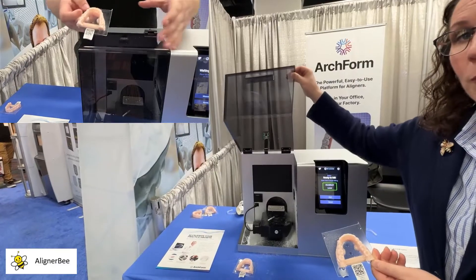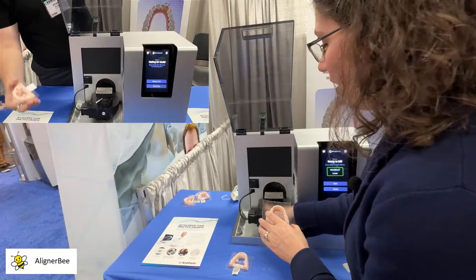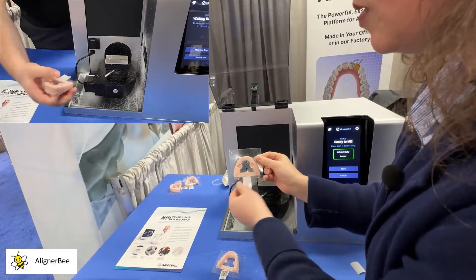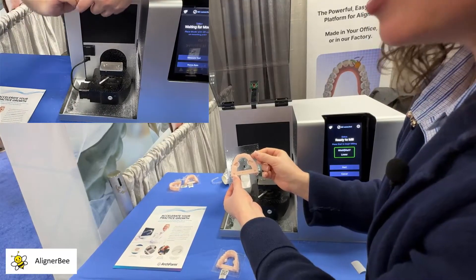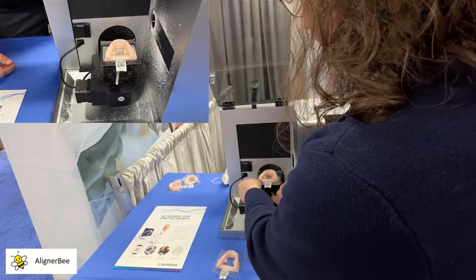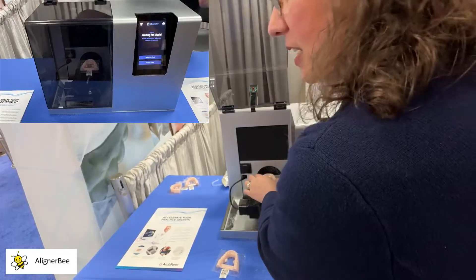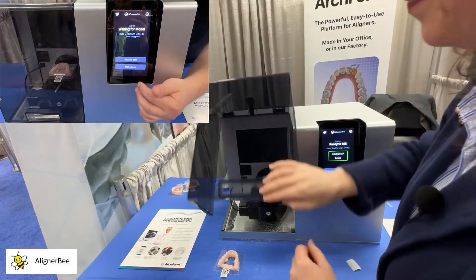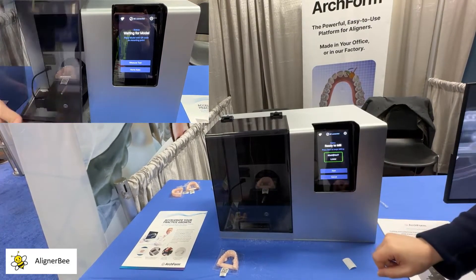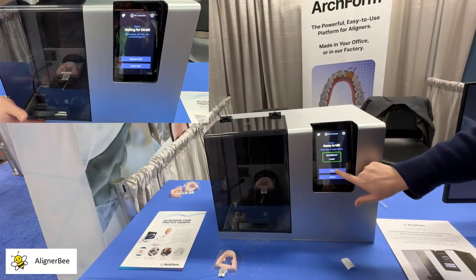I'm going to begin by opening the mill and releasing the lever on the platform where there are holding pins that correspond to the holding points that are custom printed into the 3D printed model. I'll go ahead and load the model, making sure that it is securely in the platform. Then I will close the ArchMill and come over to the screen — the camera has read the QR code, and I'll simply press start.